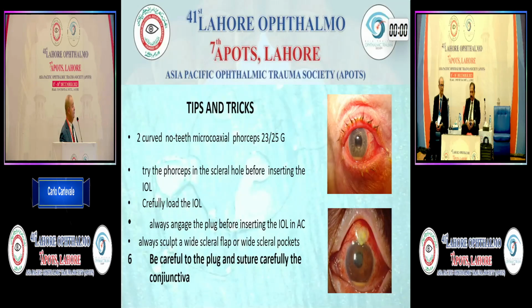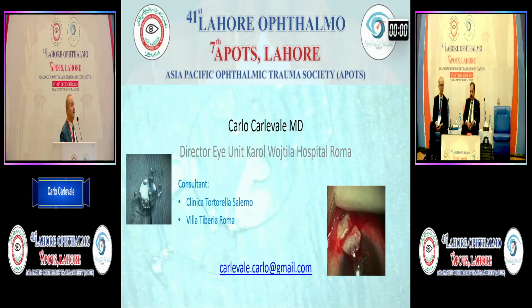And remember to suture the conjunctiva to avoid any complications, because you don't want to have an exposure of the sclera the day after the surgery. Thank you, everybody.